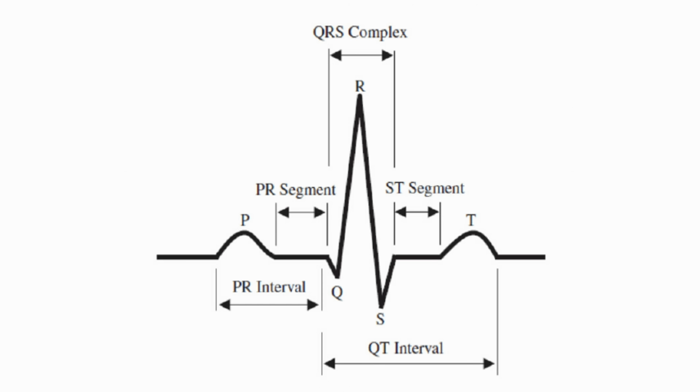And it shows you that cardiac waveform. Yep. And it's the PQRST waveform. Correct. Did you ever wonder why he didn't name it A, B, C, D, E? I did. Did you look into it? Okay, here we go. I thought you would have known this, Brad. It's a Dutch physiologist in the early 1900s, Willem Einthoven. He won a Nobel Prize, by the way.